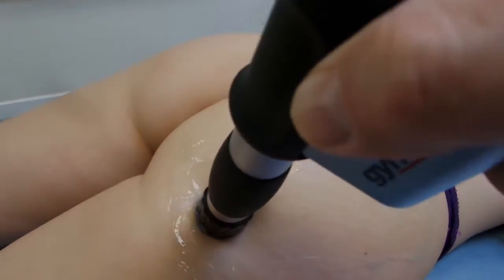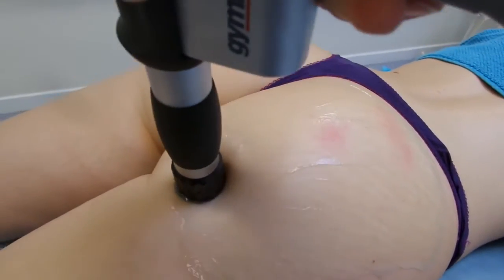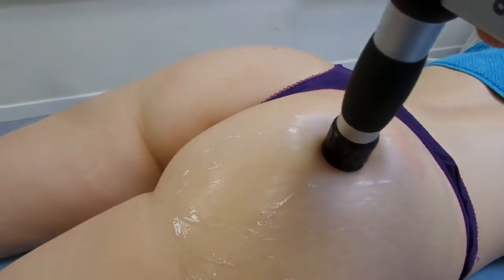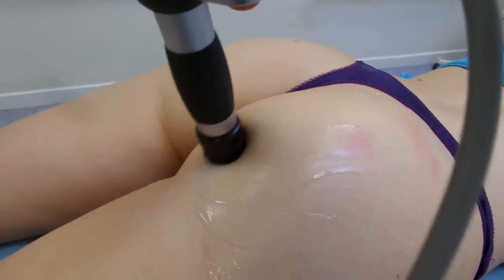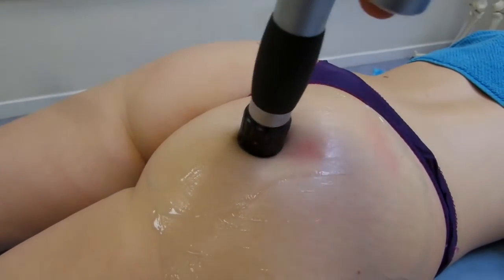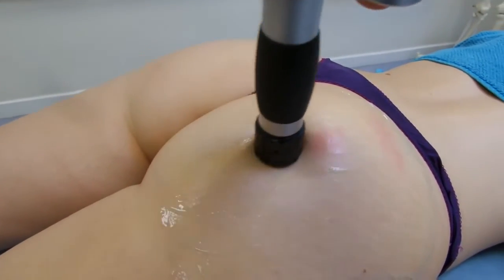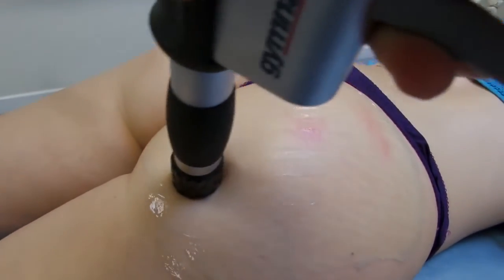You'll see here that at 16 Hz 2000 shocks goes by pretty quickly. Gymna also make a V-actor attachment for this machine to do the massaging part. There is an equation to work out the difference between the two, and that's trigger point and myofascial release treatment.